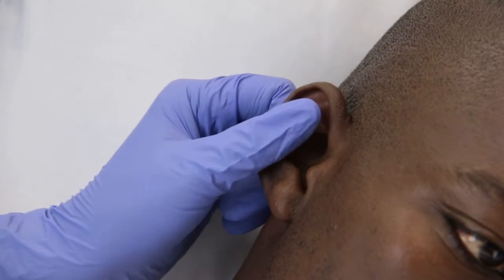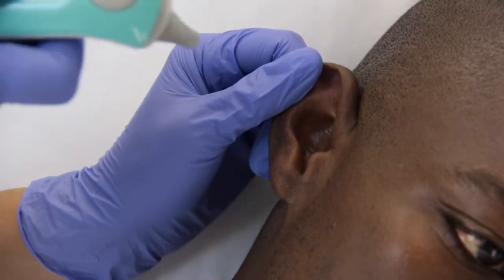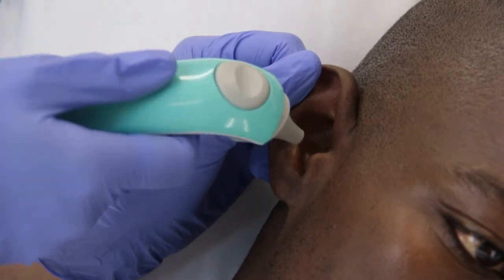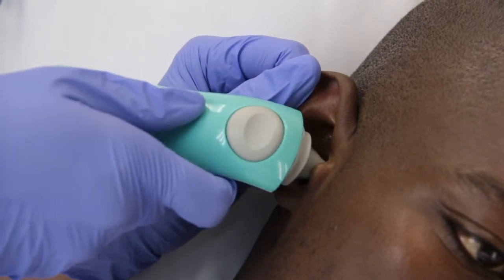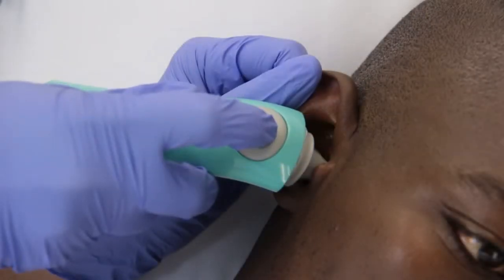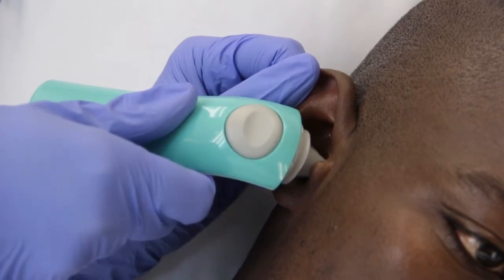Pull the pinna slightly outward and upward. Point the thermometer probe slightly forward towards the eardrum. Insert the probe slowly, using a circular motion into the ear. It must fit snugly in the ear canal. Press the start button and wait for the indication that the reading is complete.